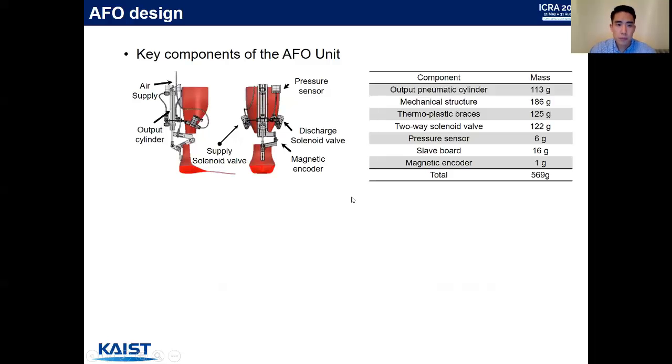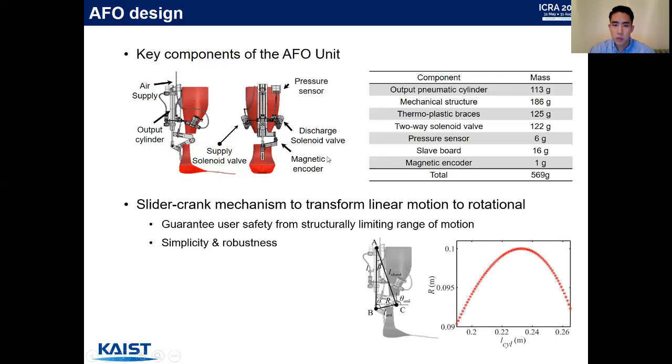Our AFO has major components including an output cylinder, a linear output cylinder, a pressure sensor to monitor the output cylinder pressure, two solenoid valves, and a magnetic encoder to measure ankle kinematics. The right table summarizes the masses of each component. We use a slider-crank mechanism to transform linear motion to rotational. This mechanism guarantees user safety by structurally limiting the range of motion, and also offers simplicity and robustness.